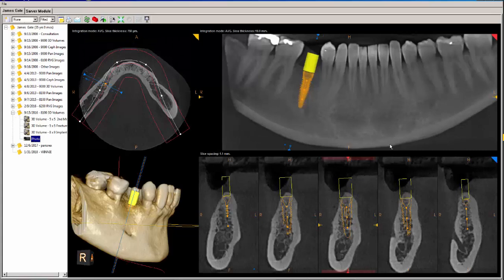Then you can visualize this on the day of the surgery. This could save you some time by not having to launch the 3D software for every surgical case. Hope you find this video helpful.